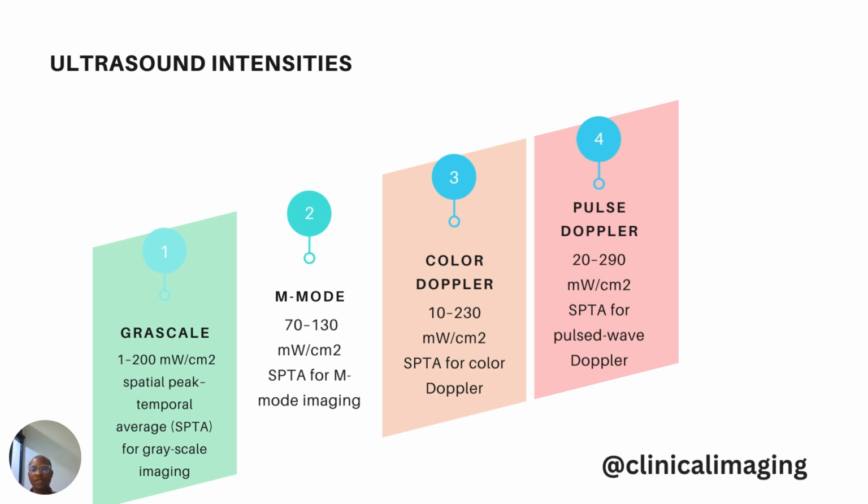Continuous wave Doppler is lower than the pulse wave Doppler. Pulse wave Doppler is the highest. So this is the reason why you have to ask yourself, that patient that wants me to demonstrate or give her the heart sound of the baby, is it right for me to do it at this point?